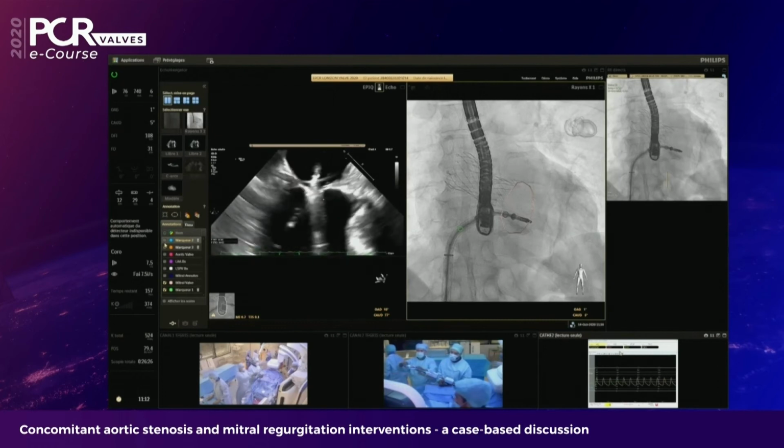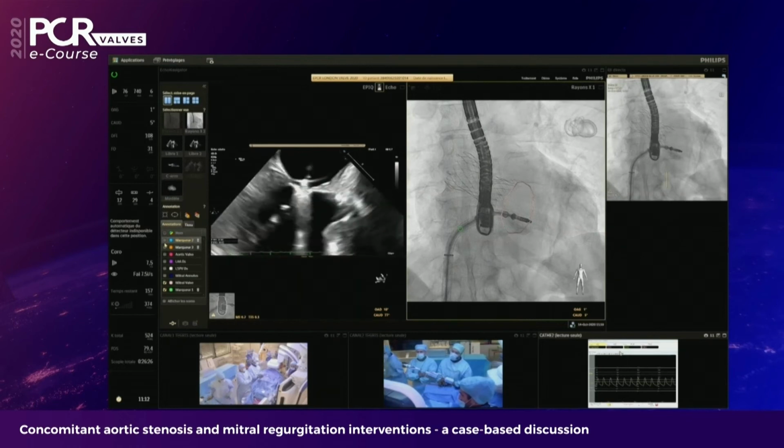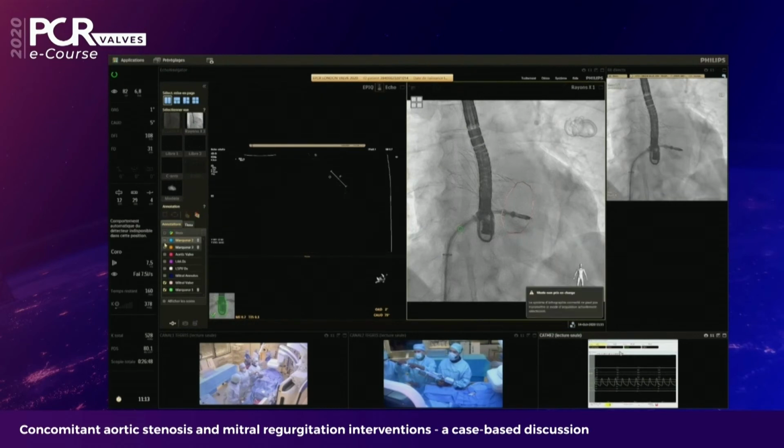Okay, so once the clip is closed, we can evaluate the result. Of course, if there is any remaining leak, any remaining significant regurgitation, but also the amount of tissue of the leaflets which is grasped and captured by the clip. One additional feature that helps you evaluate the quality of the clipping is that if you look at the 3D image here, both on P3 and A3, you have a triangular shape, which means that you have enough quantity of tissue, but also the quality of grasping. This triangular shape means that the anterior-posterior effect of clipping is met, which is a quality feature of the clipping, and the clipping will have a chance to be stable.